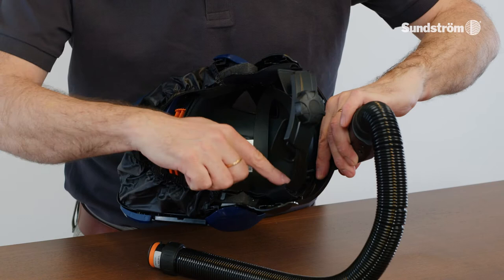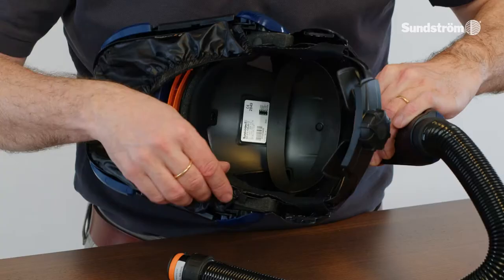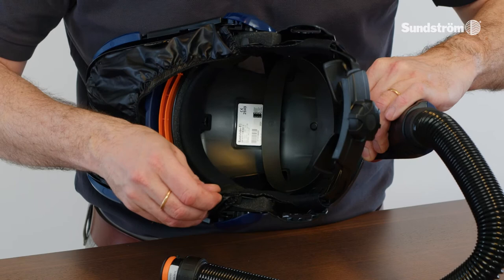Check that the sweatband and forehead seal are clean and in place. The airflow deflector can be adjusted. The face seal hooks are attached and the face seal is fixed, elastic, and in good condition.